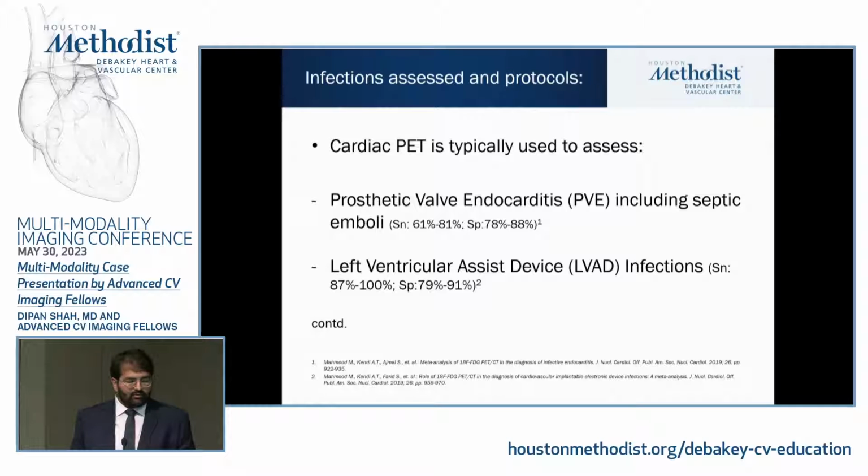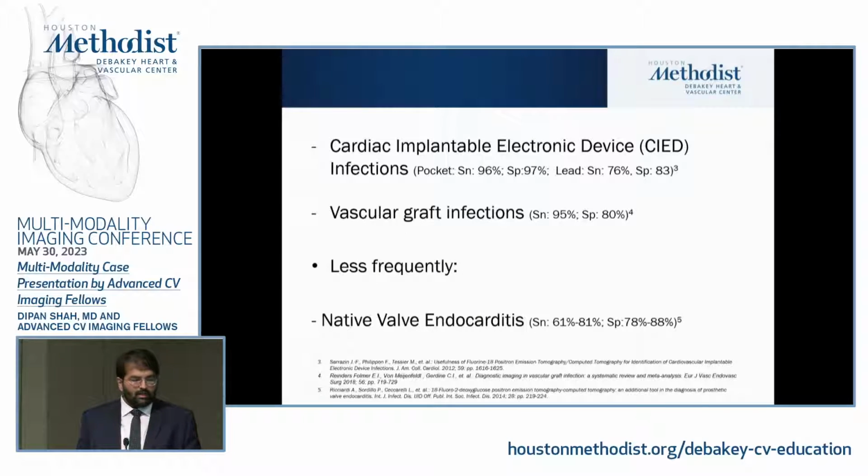It's used for left ventricular assist device infections, cardiac implantable electronic device infections, so that's pacemakers, ICDs, and such. We've actually even used it here for CardioMEMS devices in the lungs or in the pulmonary vasculature. And vascular graft infections. We've had a lot of use from our vascular surgery colleagues, who have been ordering these studies to evaluate for graft infections.